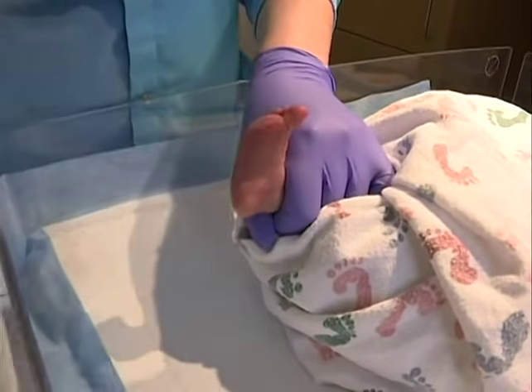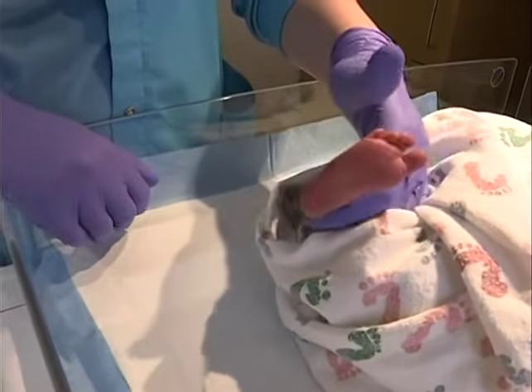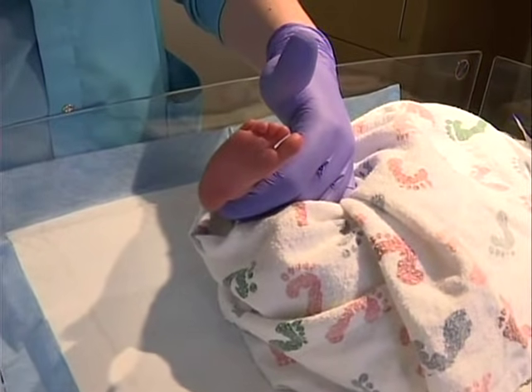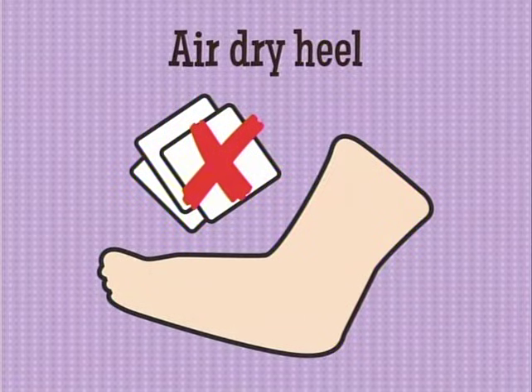Disinfect the skin with alcohol. Vigorous rubbing during this step stimulates blood flow to the area. Allow the skin to thoroughly air dry so that residual alcohol evaporates and the antiseptic action of the alcohol is effective. Residual alcohol causes rapid hemolysis that may have an adverse effect on the results and may cause pain or stinging to the infant.